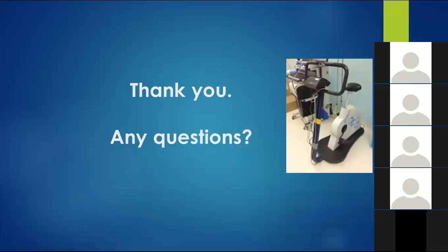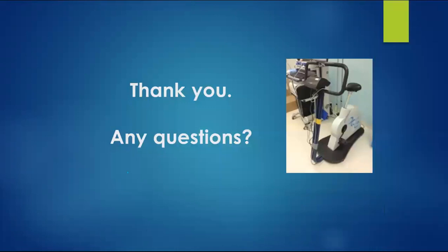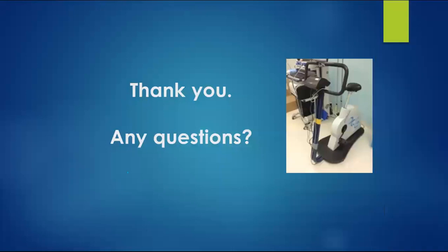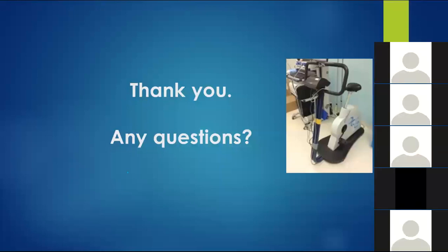One of the points the paper mentioned was if you combine the Cpet with a dynamic preoperative exercise program, and then are able to monitor and map each patient's Cpet variables 6 months prior to surgery, and then actually integrate it within the life of the patient, so being able to do this in the gym, for example, that can improve outcomes. And there's research looking at this particular individual patient perioperative pathway and the use of Cpet. That role is a completely different role. Yeah. A preoperative test.